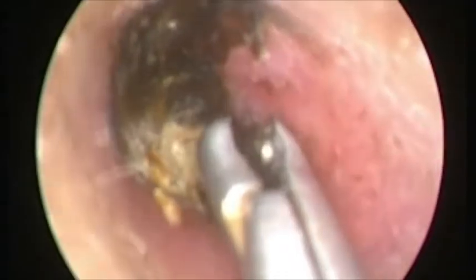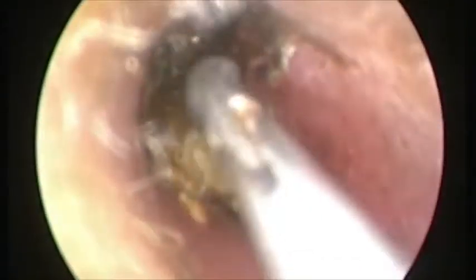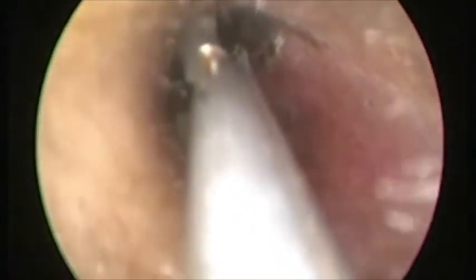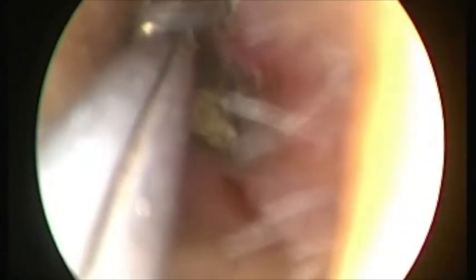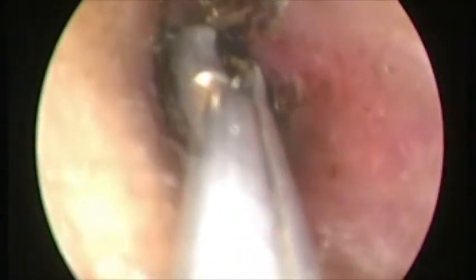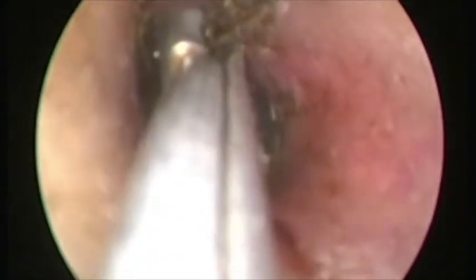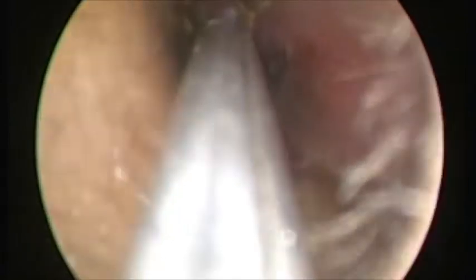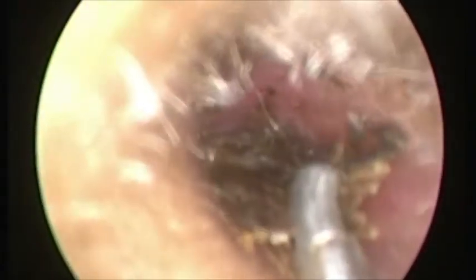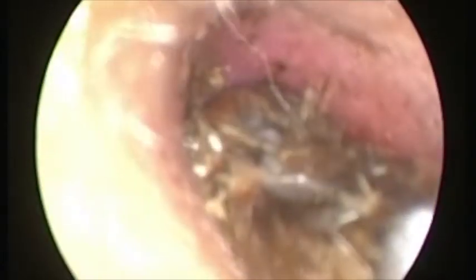Here goes our second attempt, where we finally managed to find a plane of cleavage between the foreign body insect and the external auditory canal skin. Here we have grasped the foreign body, loosened it, and separated it out from the ear canal.